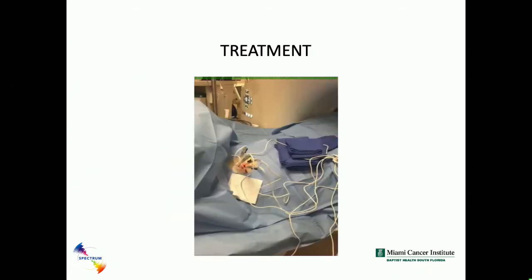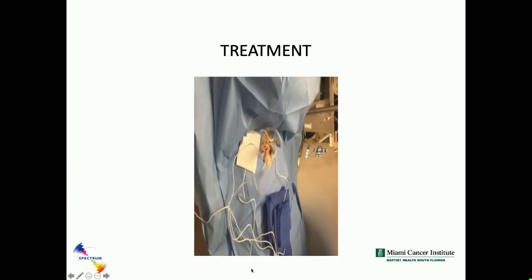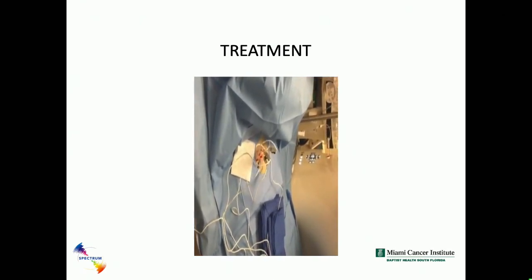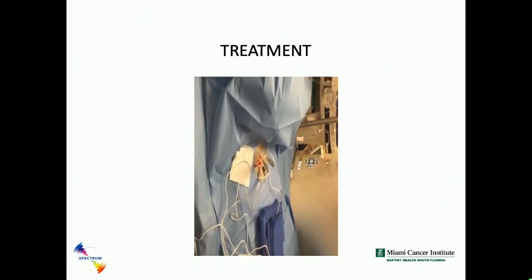This is also a short video. Once the needles are in place and the distance has been confirmed, we turn on the generator. What you're going to see is the movement of these needles, which is very different compared to microwave or cryoablation. If you've not seen that, for physicians to see it for the first time, it can be a little alarming. Usually, once you have the needle placed in the liver, there's not much motion, but we're always watching it just to make sure that the probes don't move. Next slide, please.